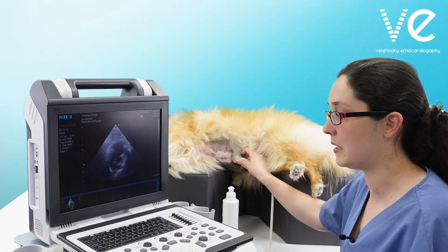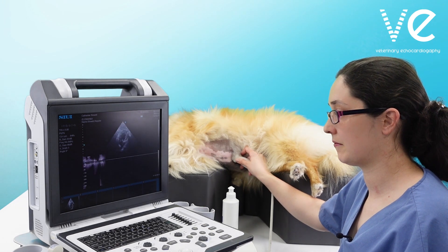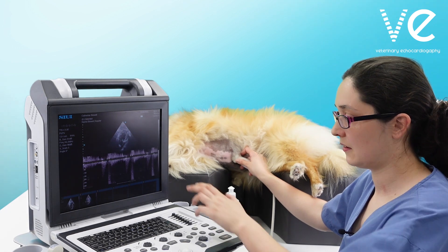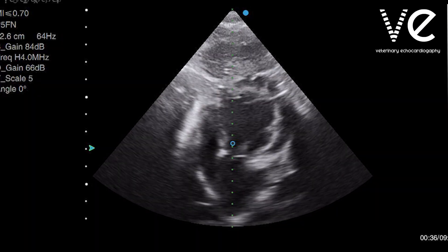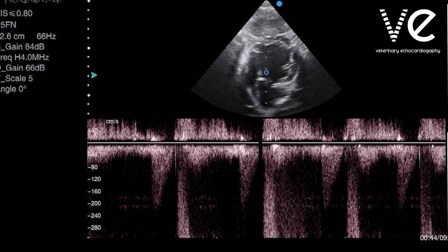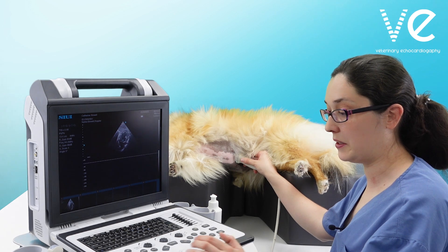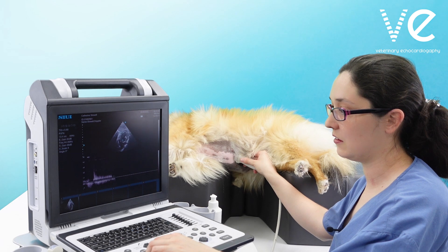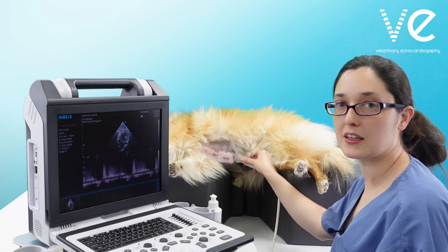I'm going to put my continuous wave beam straight down through the valve. And here I have her peak aortic velocity. In this particular dog we also have aortic regurgitation, so I'll adjust my baseline down, change my scale, and get a nice aortic regurgitation trace as well.